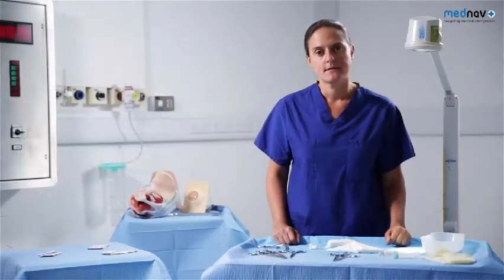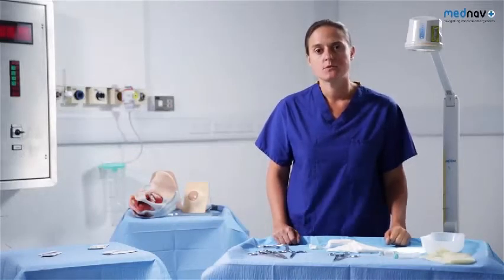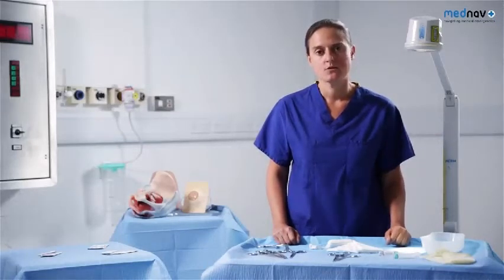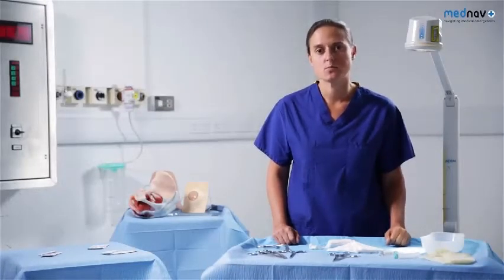For effective perineal repair, there are some essential prerequisites. You'll need to be able to position the patient adequately. She will need to have understood and consented to the procedure, and she'll need adequate analgesia. It's important to repair the perineum as soon as possible after delivery to decrease the chance of hemorrhage or wound infection.